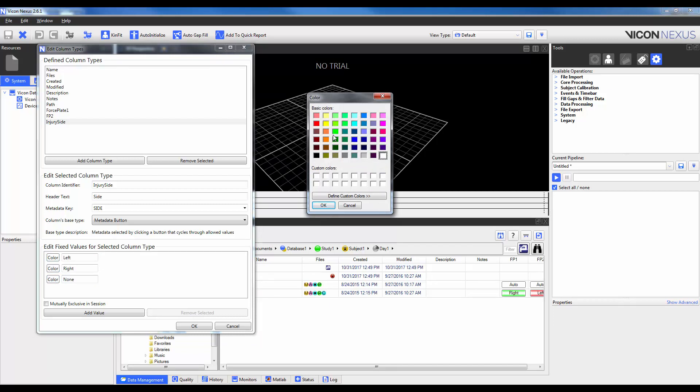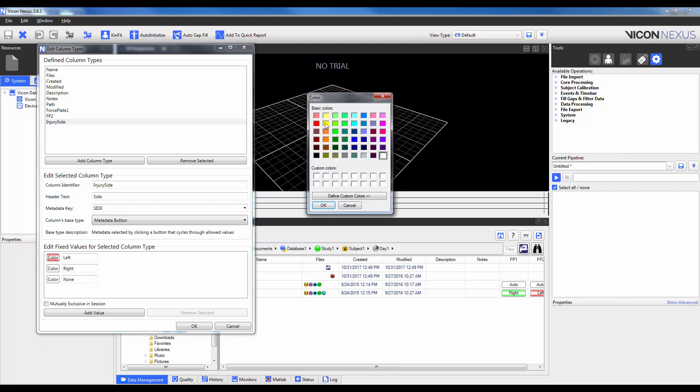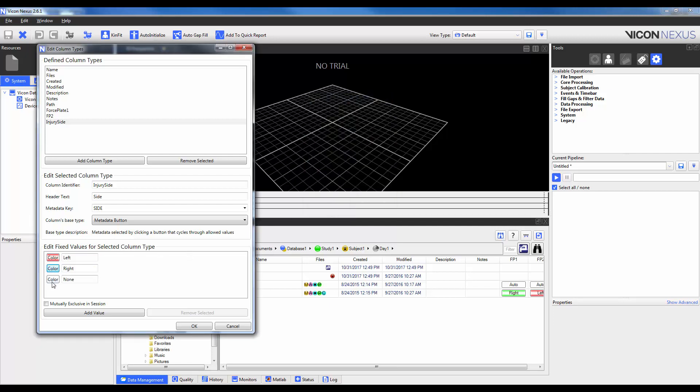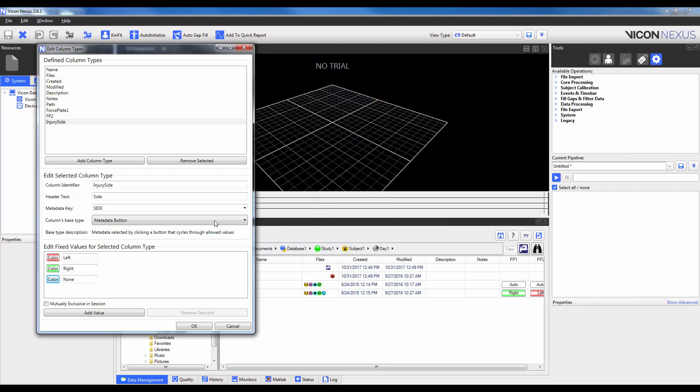I'm then also going to apply a color to each so that they correspond to the colors that are in plugin gates. So for the left side, I'm going to choose red. For the right side, I'm going to choose green. And then for none, I'll just choose gray. Okay, so I'll show you the metadata button in a second.